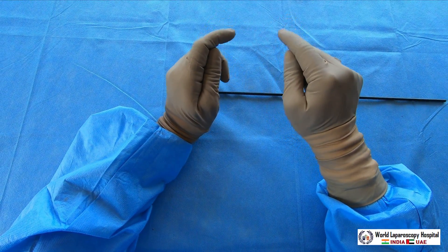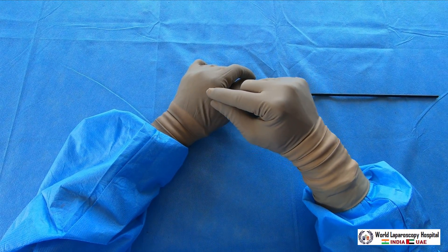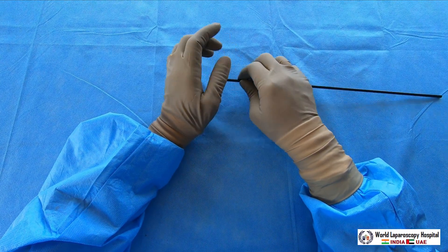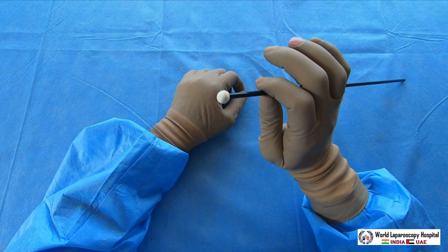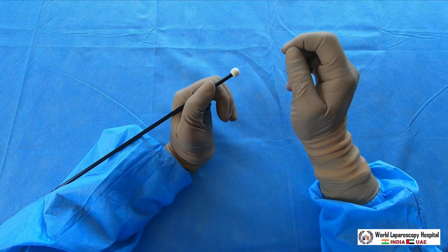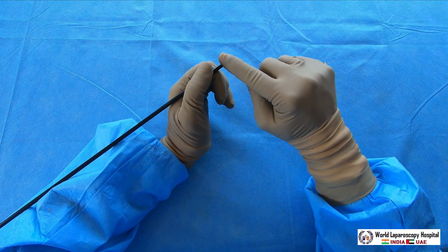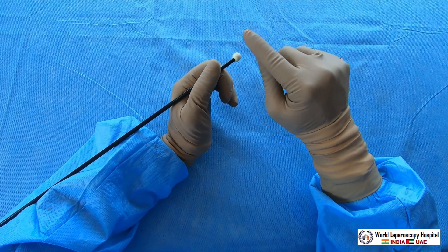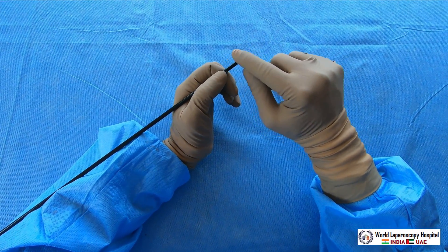Alternatively, you can make your own pledget by folding a three to four centimeter gauze piece, hold it with a semi-traumatic grasper, and use it for blunt dissection. The problem with making your own pledget is that if you accidentally lose it, there will be a big issue — a foreign body inside the abdomen. The good thing about the commercially available peanut is that it cannot be detached, so there is no possibility of accidentally losing it inside the abdomen.